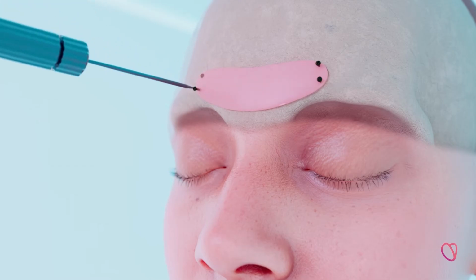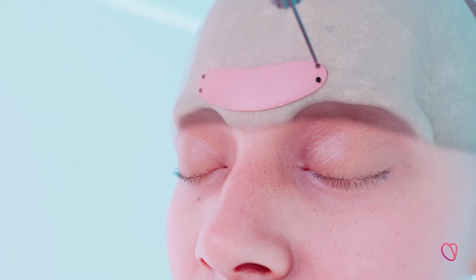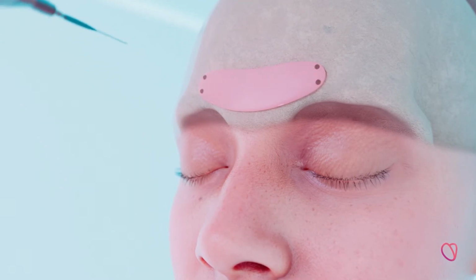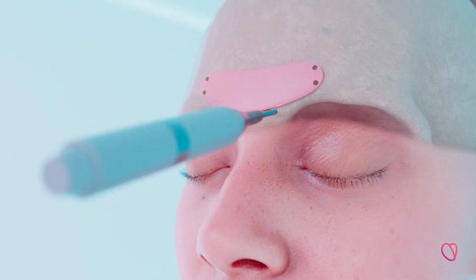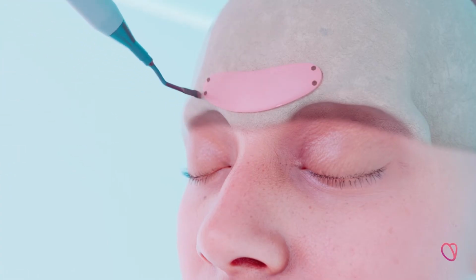Through this approach, we gain full access to the forehead and orbital region. The surgical guide is then fixed in place. Using ultrasonic technology, a bone cut is performed along the cutting guide. This significantly increases the safety and predictability of the procedure.